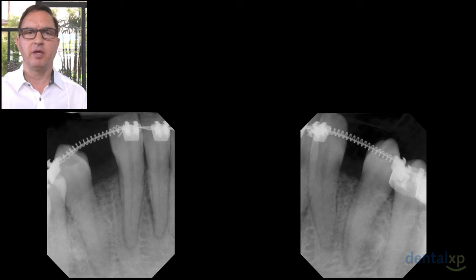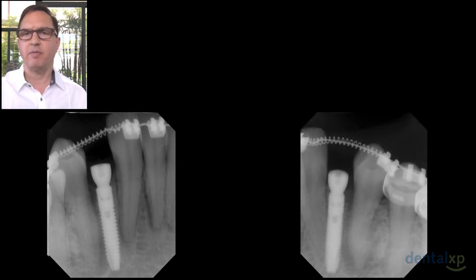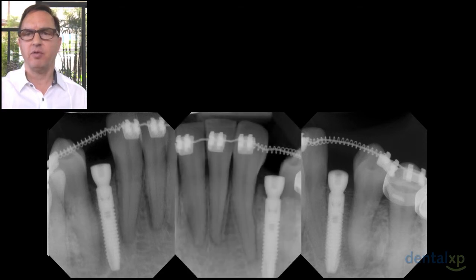computer-generated pilot guide. Now you can see on the left-hand side that the implant in the area of the tooth number 27 is placed without any damage to the adjacent root surfaces. And on the right side, you can see that, of course, tooth number 21 is clear and free, but we're not sure about the patient's cuspid in this location. What we do see is by changing the angle of the orientation of the radiograph that we're clear from the tooth number 22 that we have not injured it either. So there's no one single view that would represent the full context of the 3D volume of information that we're here to study.